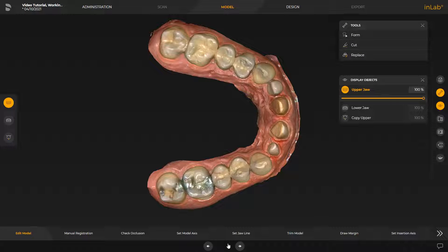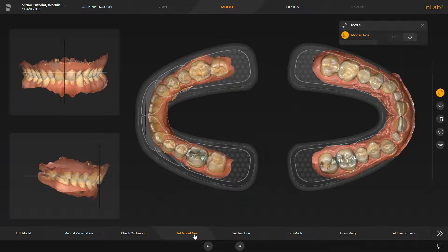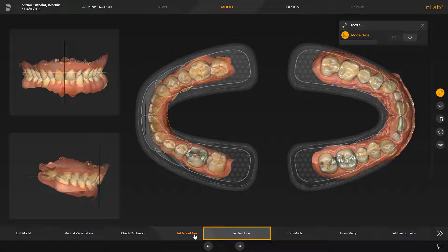Next, we go to the Set Model Axis step. The model axis is automatically suggested by the software. If needed, it can be redefined in the three different views. This alignment is required to calculate optimal initial suggestions. This applies also to the next step, Set Jawline.